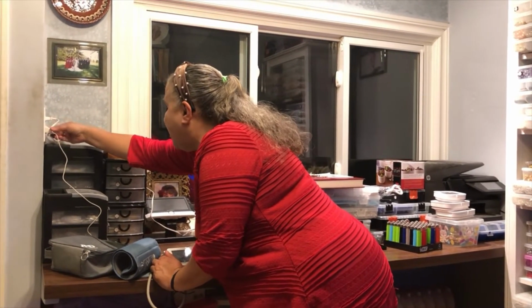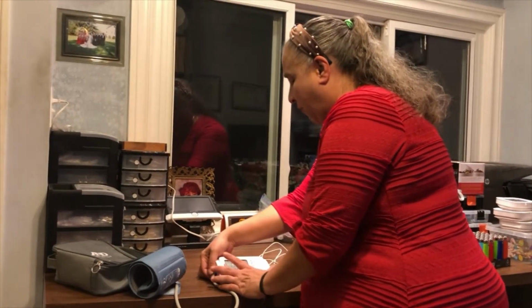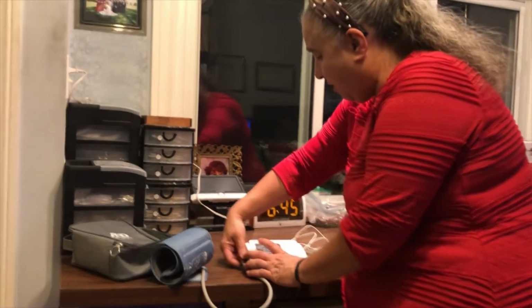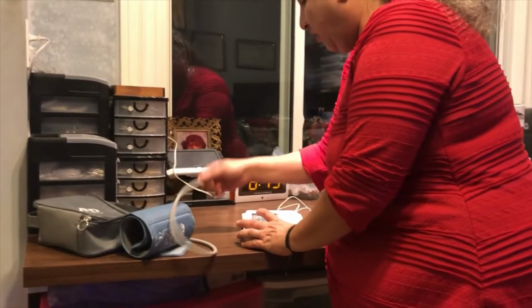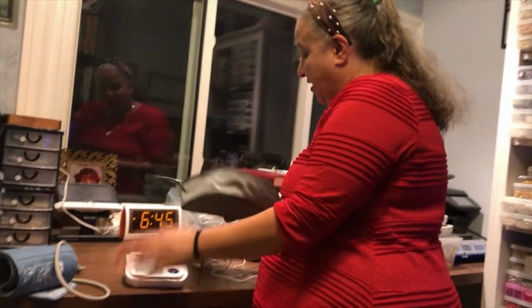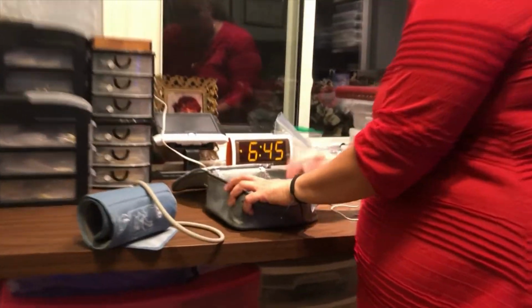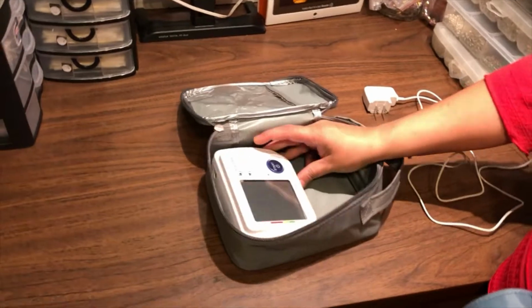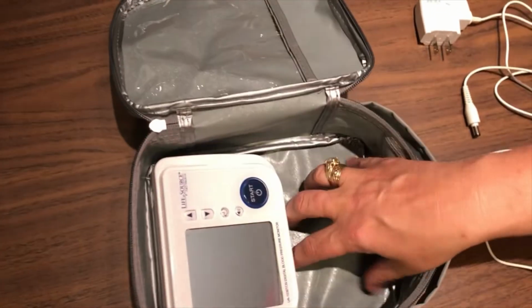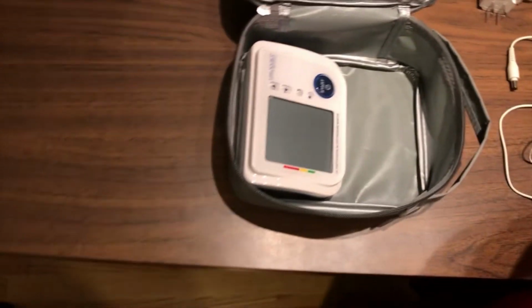So you're done. So you unplug your device. You unplug from the back of the device. You unplug the plastic tube. You've got your carrying case. What did I do with it? Here it is. It really is up to you how you pack this up, but you take the device, put it in, okay? And then I just laid it on one side of the bottom part of the vinyl case.